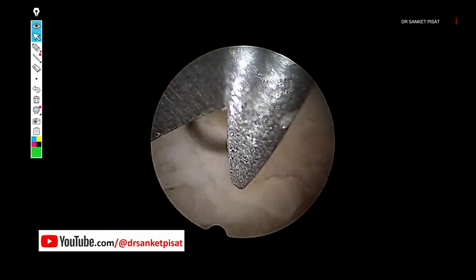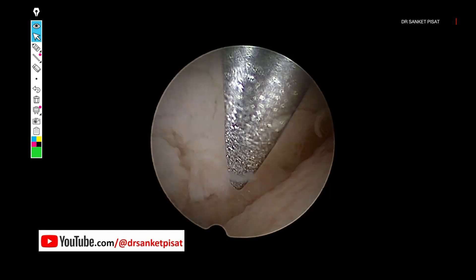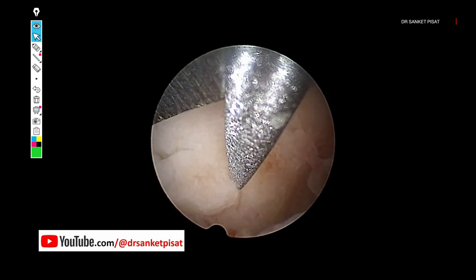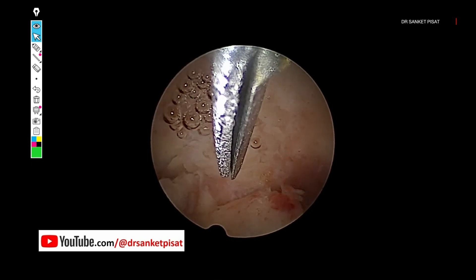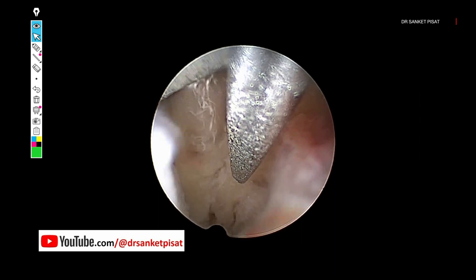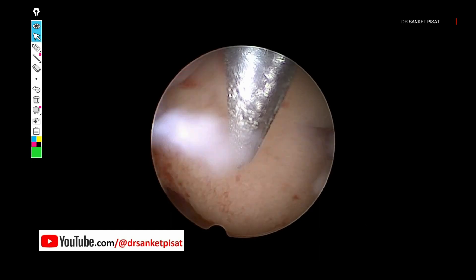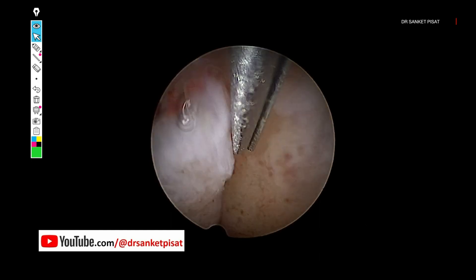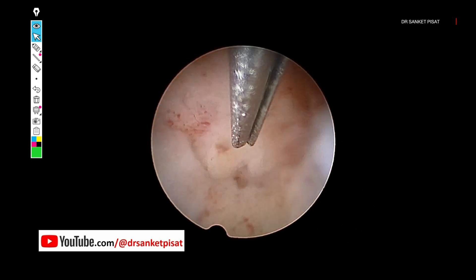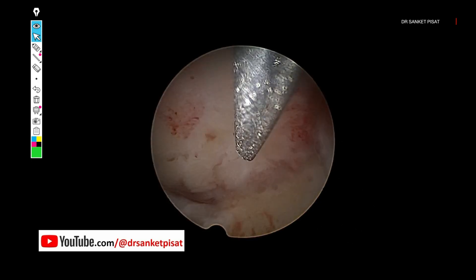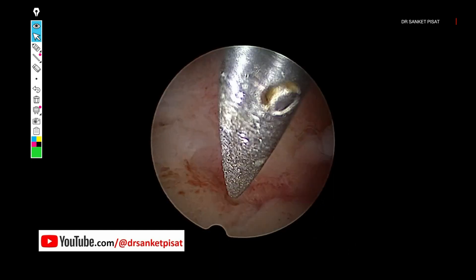Some very small millimeter-size tags may remain, though I am trying my best to cut right from the base. A very small amount of tissue remaining behind is really of no consequence — the body takes care of it and there is no recurrence. However, if you cut the polyp in half and leave half behind, there is a possibility of recurrence. With any technique recurrence is always a possibility since polyp growth depends on estrogen, which we cannot block completely, but good surgical technique may reduce the incidence of recurrence.